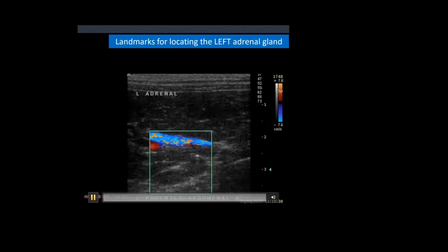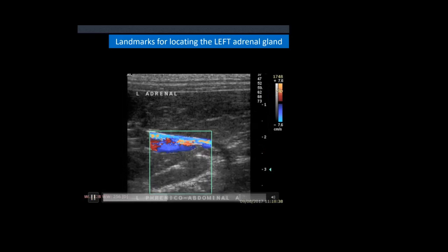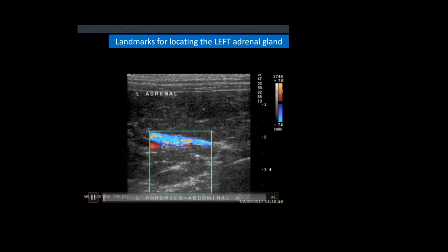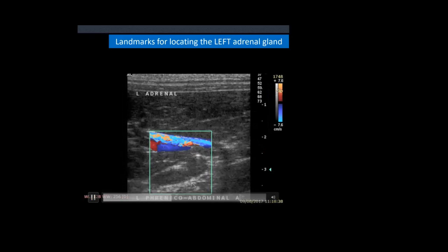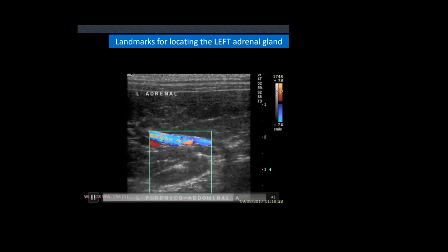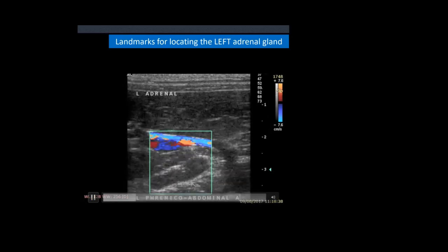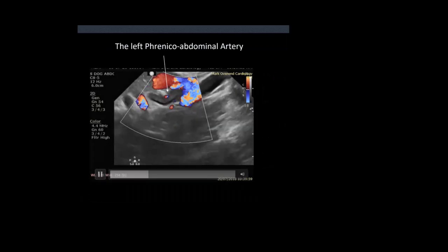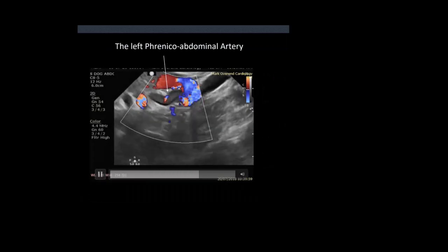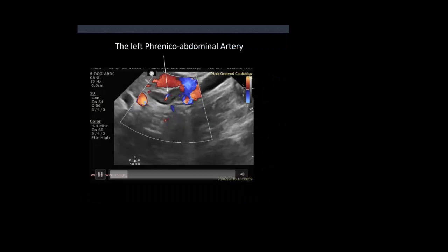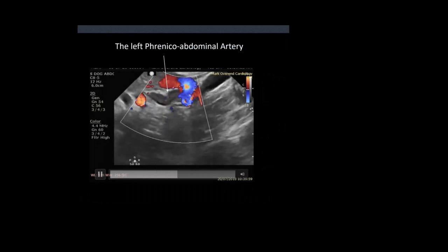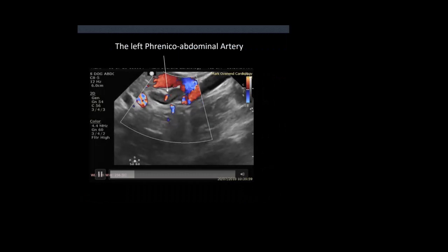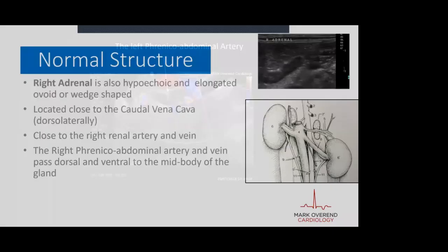I've put some color flow on to show the vessel running across - you see a little whisper of blue from time to time, which is the phrenico-abdominal vessels. Here's a more recent example: aorta, left renal artery, adrenal gland, and there's the phrenico-abdominal artery and vein.